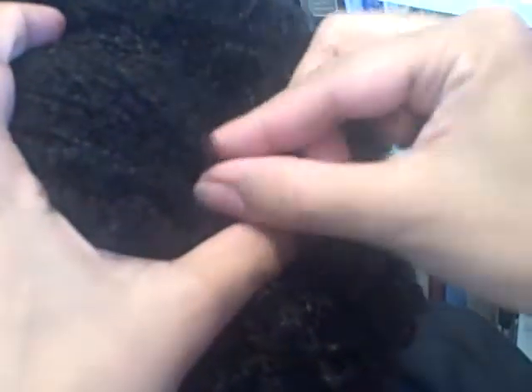Obviously, depending on the texture and curl of the hair, it may be a little harder to isolate. So here I have 20 strands of hair, again from underneath the top layer.